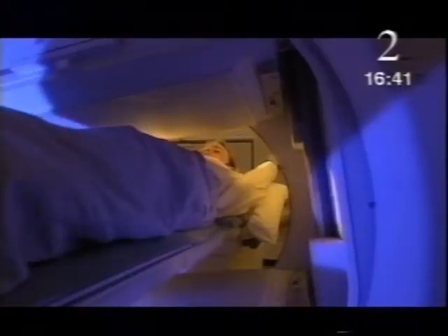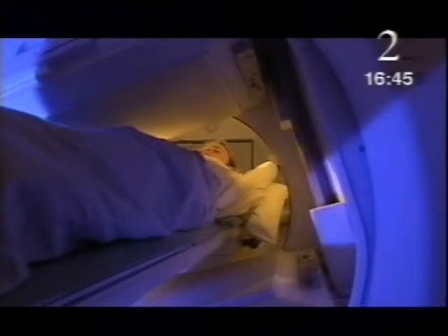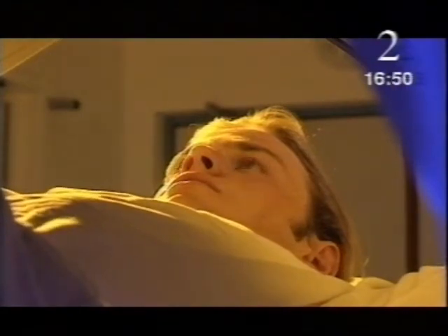Some of these scans were a little bit claustrophobic, particularly the one where they took a scan of my whole body. It's quite difficult to lie completely still with my arms above my head, and that was the main problem, making sure my arms didn't fall asleep. It took about 3/4 of an hour in the end. The cameras are attached to a computer. It slowly builds up a picture as each gamma ray is detected.